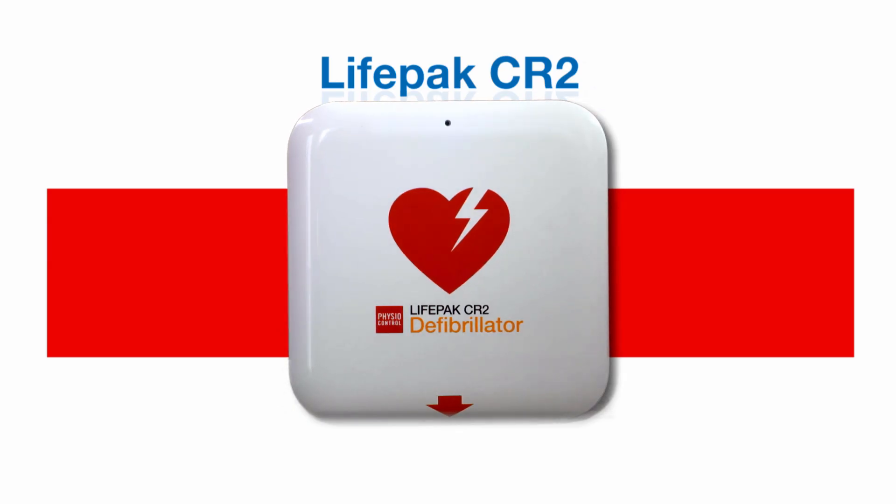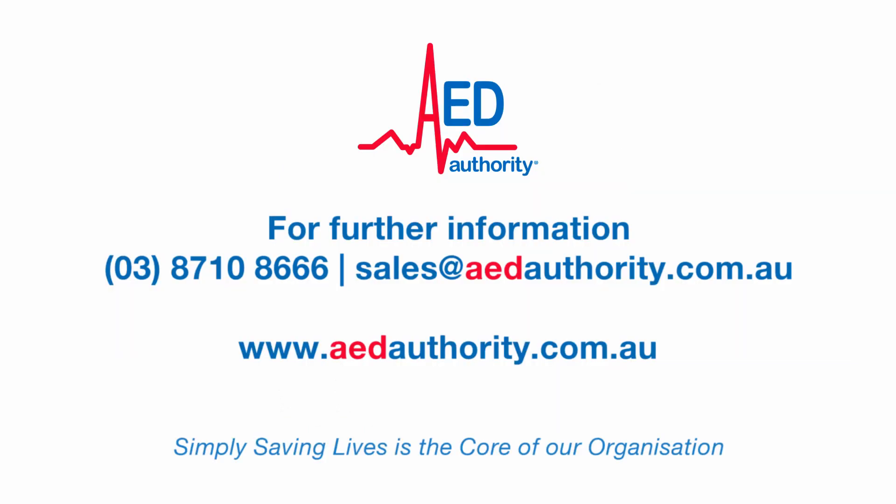To ensure your defibrillator is working, once a month simply check that the light is flashing and you can rest easy knowing your device is ready to go in an emergency. AED Authority Australia is the leader in sales and management programs of defibrillators. Simply saving lives is the core of our organisation.